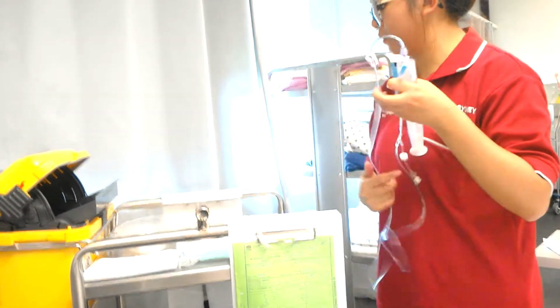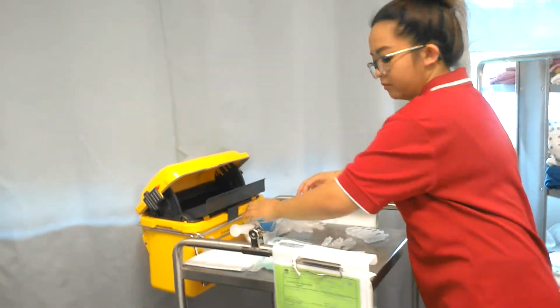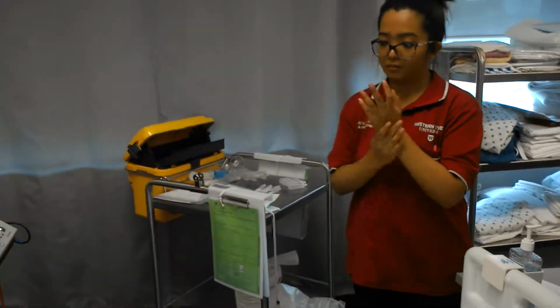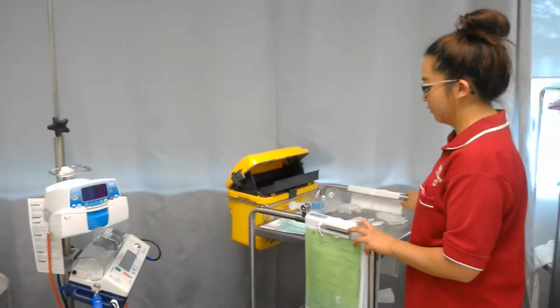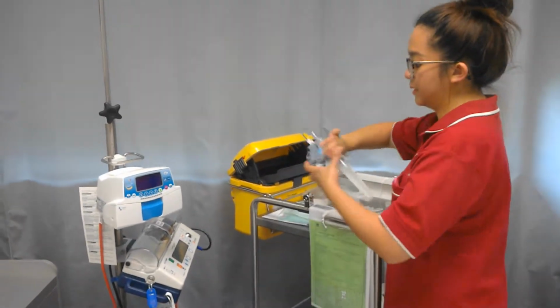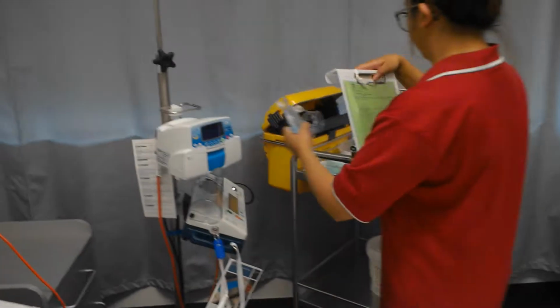Okay, so my lines are all primed. I just need to connect this now to the PCA machine. And second nurse, can you please be with me when I connect it?